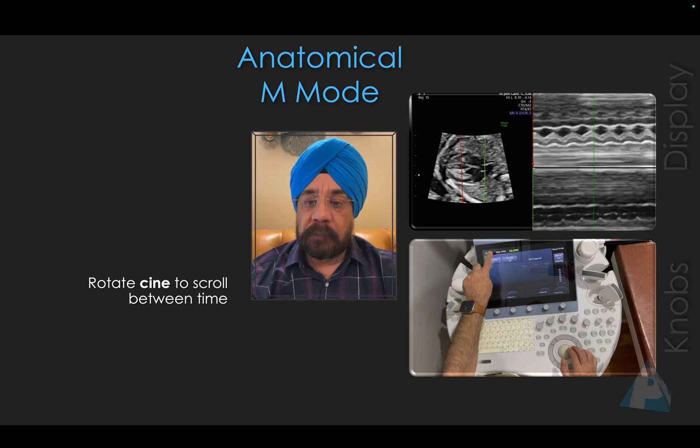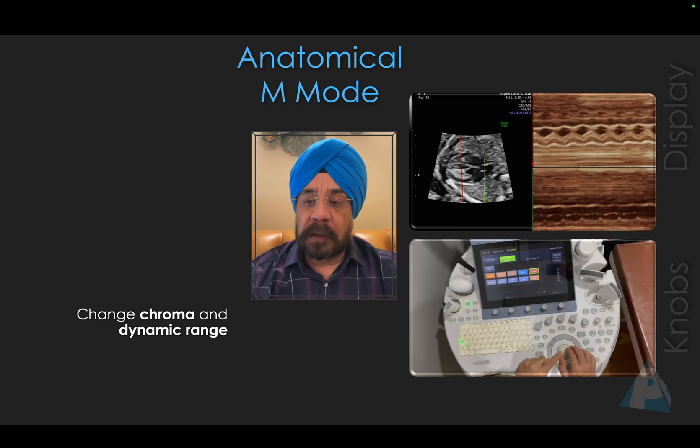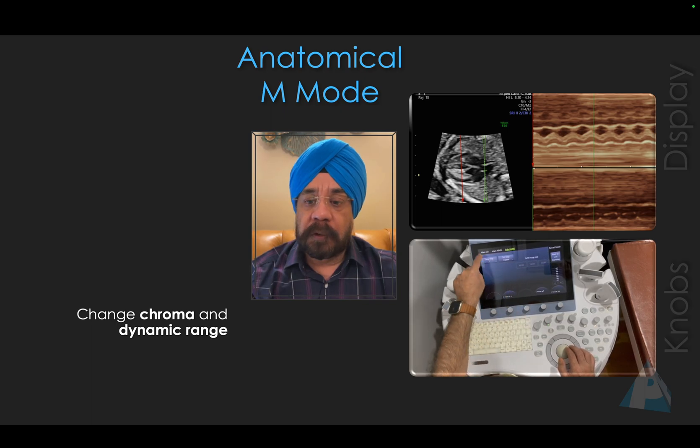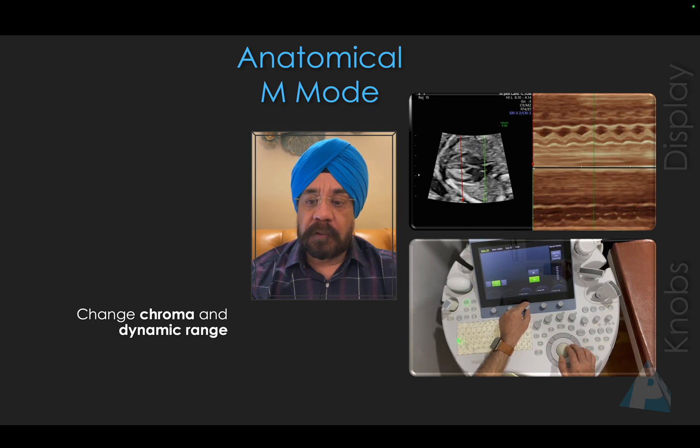Once you've done that, you can improve the image by pressing chroma. I like the copper chroma setting — it gives you a very realistic image and improves the quality of the M-Mode. Then you can go to the main menu of 2D and toggle the dynamic range to get the best view that suits you.